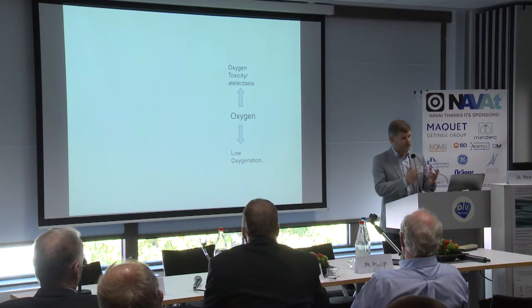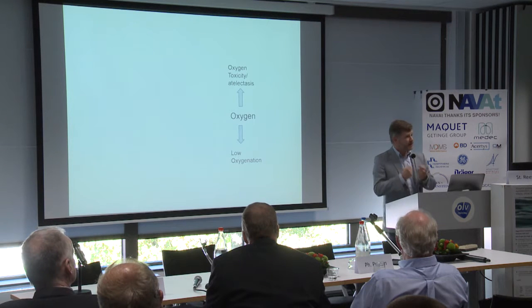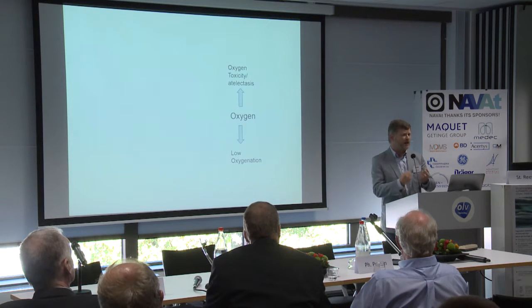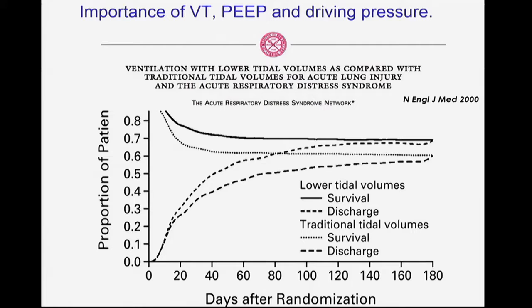And that's where I think we should be moving, incorporating our physiological understanding into bedside practice, using our well-known mathematical knowledge of how things behave. And we've known many of these systems in quite some detail for quite some time. So this is the one compromise, but we have other compromises. We know from the ICU that low tidal volumes are protective, and low driving pressures are protective, accommodated by the correct PEEP level, of course. And that's being started to move across.